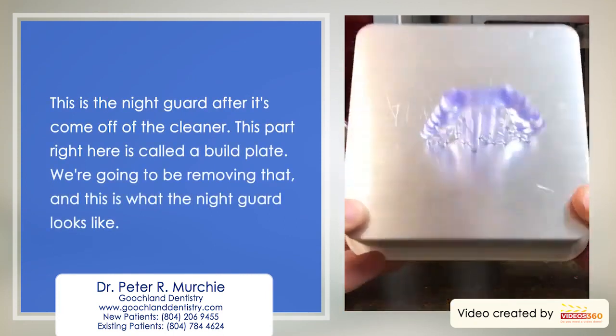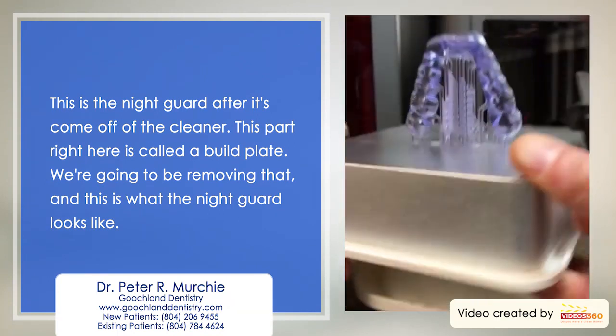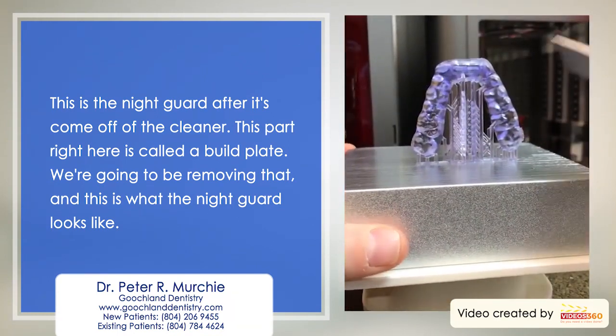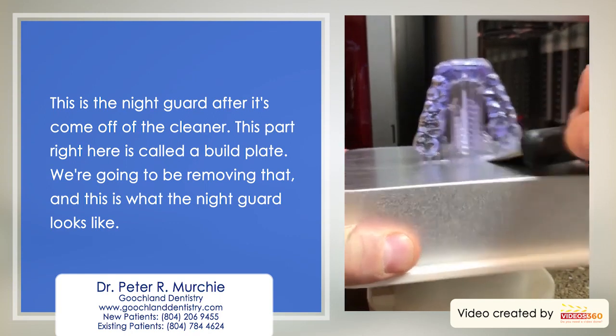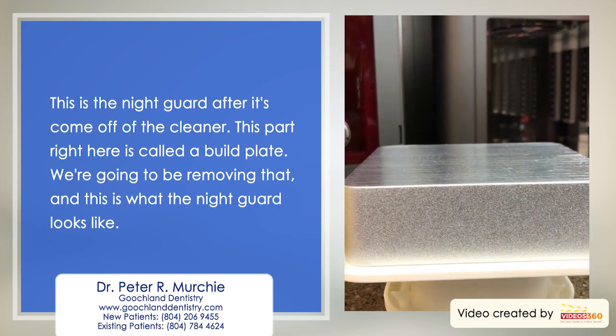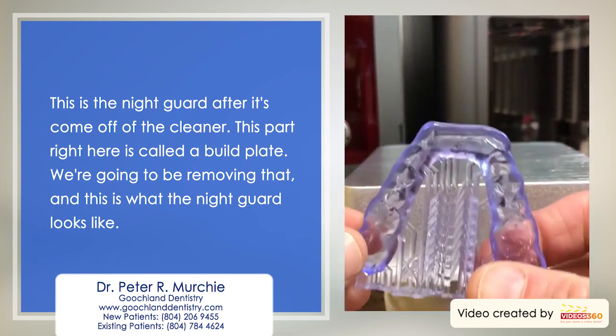So this is the night guard after it's come off of the cleaner. And then this part right here is called a build plate. We're going to be removing that, and we just kind of scrape it off. Oh, there it goes. This is what the night guard looks like.